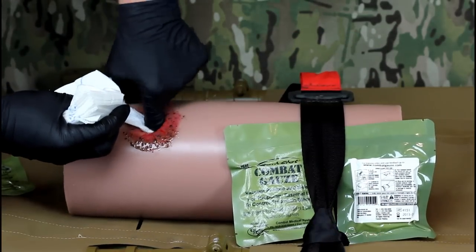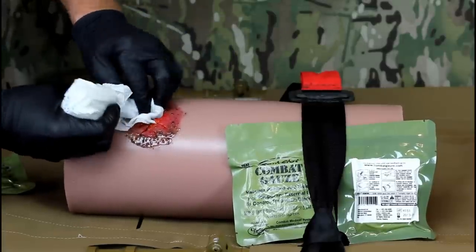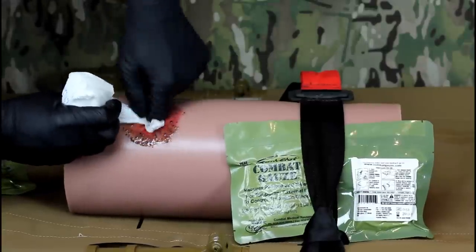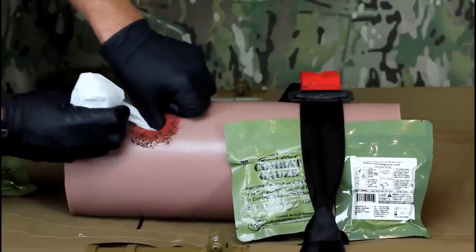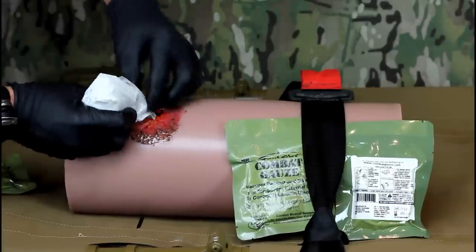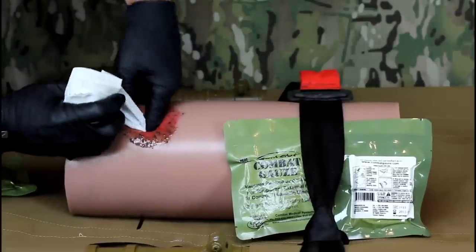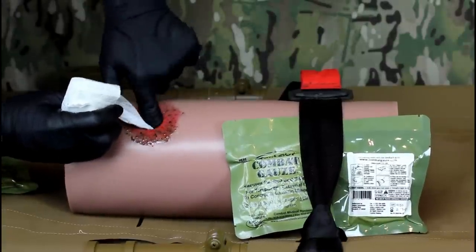Pack combat gauze into the wound. It is vital that you get the gauze into contact with the arterial or venous breach and do not simply cover the wound with the gauze. Be aware that a large injury may require more than one combat gauze to pack the wound fully. Any excess gauze should be used to apply pressure over the wound after packing.